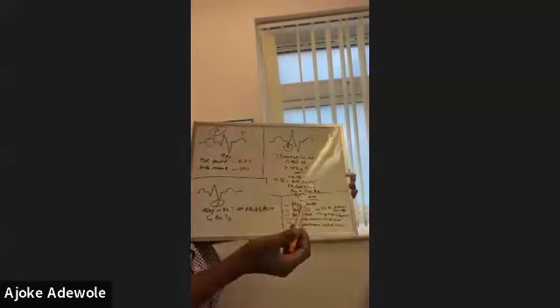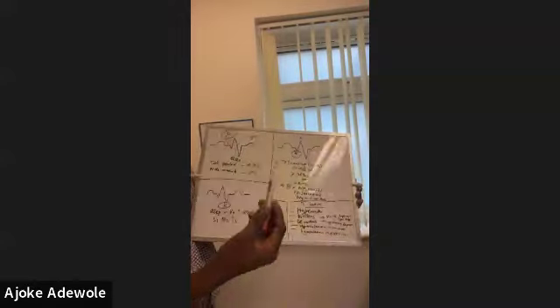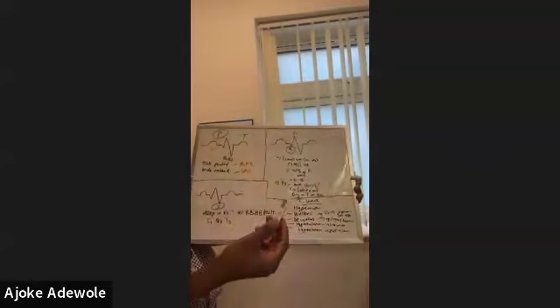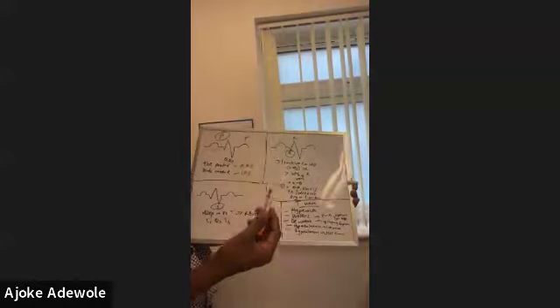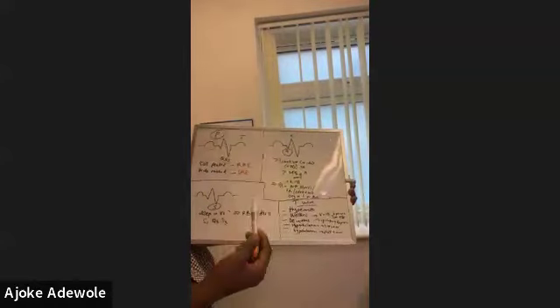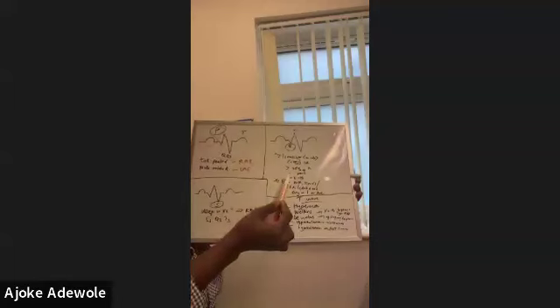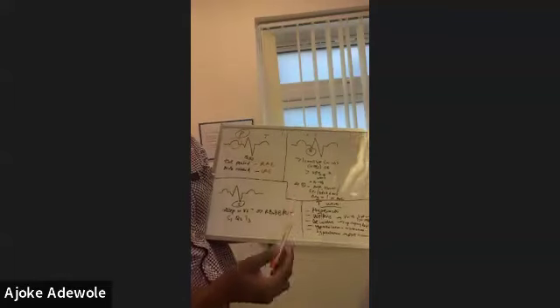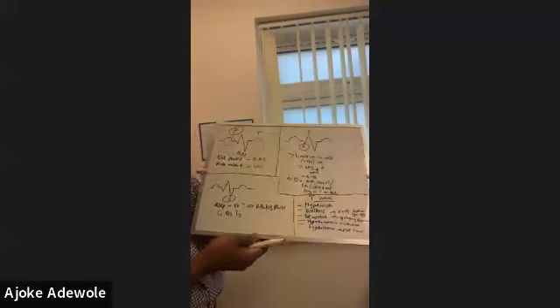It takes some practice, but knowing the basics helps, because then you can say, oh, well, given this patient's history, they've come in with chest pain for maybe 4 or 5 days. They're not currently in pain, but the pain sounded cardiac, and you're seeing an ECG with a Q wave that's a bit wide, more than one square or more than 25% in V1 to V3, then your antennas are up and you're asking, what is really going on here.